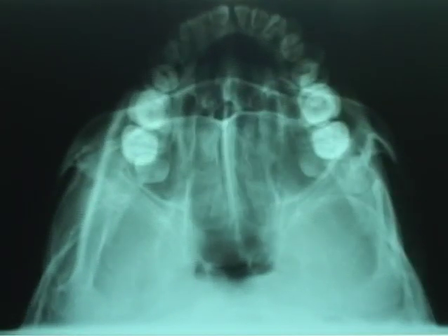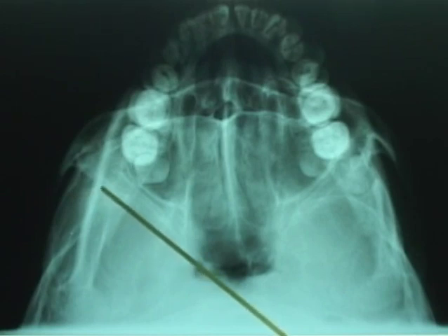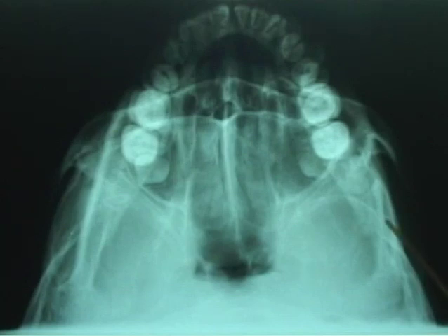This is this young man's submental vertex X-ray, and it shows the mandible, which is outlined here, is not located in the center of his cranial base, but is displaced off to your right. You can see the difference between how much the ramus of the mandible is inset from the lateral surface of the skull on his right side and how it is overlapping the lateral surface of his skull on this side. The whole mandible is displaced to your right.